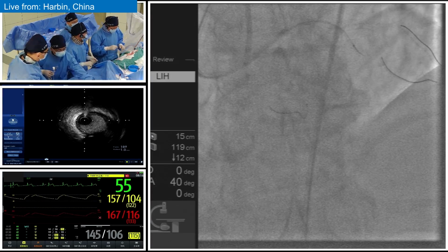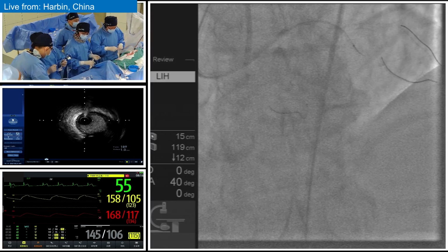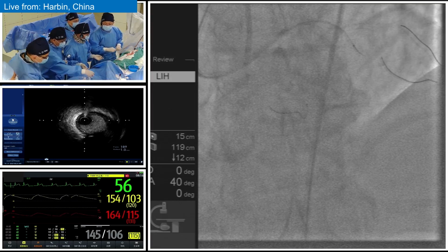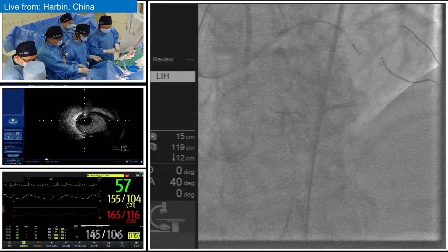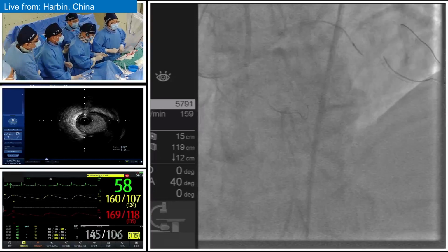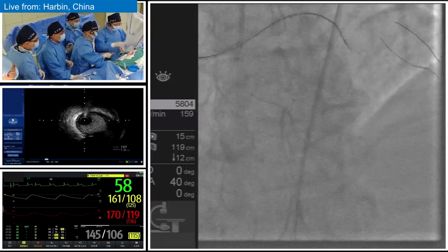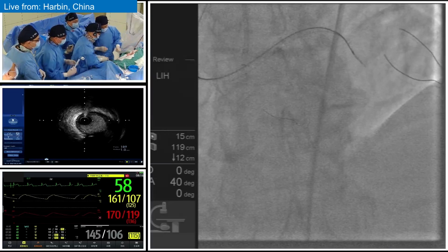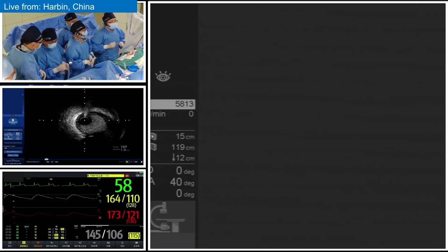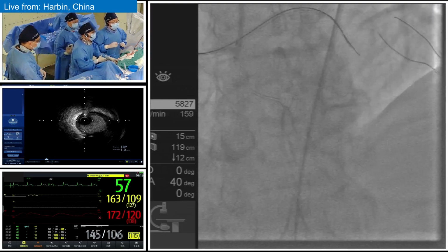It's a very strong predictor of antegrade failure because, from the antegrade parallel techniques, the wire may easily go into the patent side branches, and after the antegrade attempt may cause severe damage to the ostium of the side branch. There is also inability to wire the occlusion due to preferential guidewire entry into the patent branch and failure to engage the CTO. Balloon inflation in the side branch or a non-inflated balloon can block the wire. So these may be some tricks for antegrade wire escalation during the plan of the proximal cap.